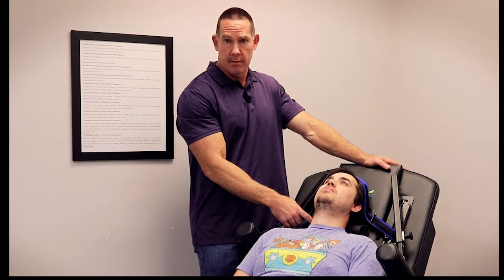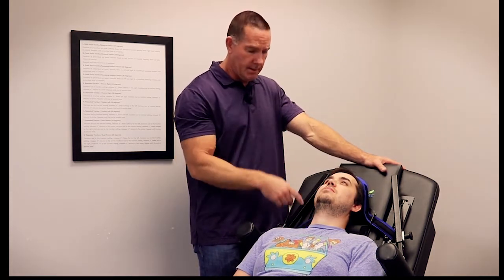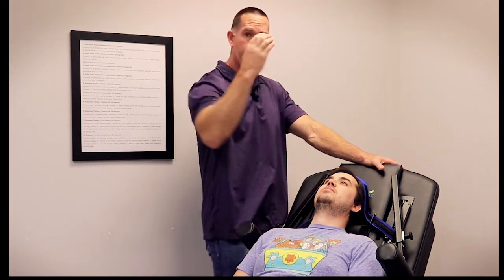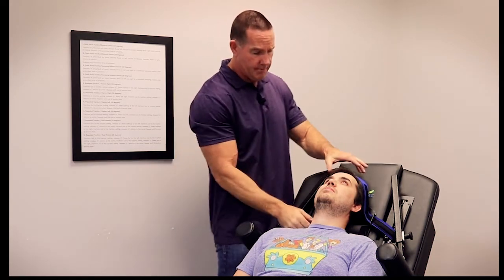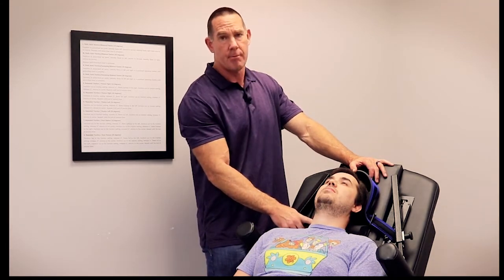I'm a pretty big guy — I'm six foot four — and I use a single pillow when I'm using it as well. You may be able to build that up as we get to a better curve. Most of these people we're using this on are supposed to have a curve, but they either have a straight curve or a reversal of the curve. So when you go to put that over the top of the pillow, it's not going to be real comfortable the first time or two. I always instruct my patients: in about two to three minutes of being on this, those intrinsic muscles will relax and just let the head settle down. So if it's uncomfortable from the very get-go, make sure you drop this pillow down to the mid to lower part of the cervical.